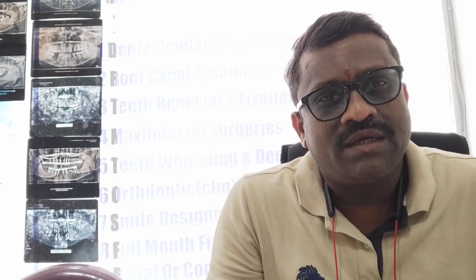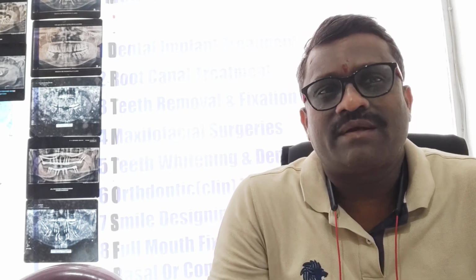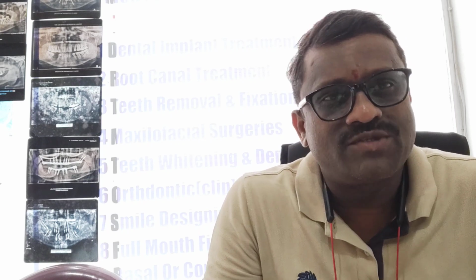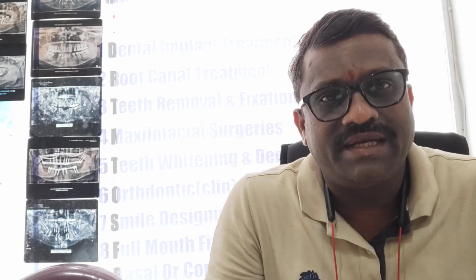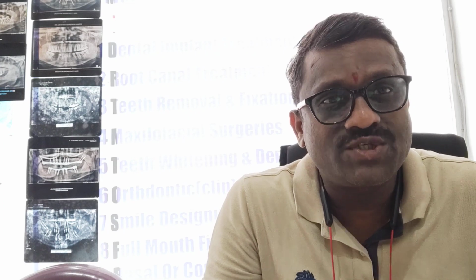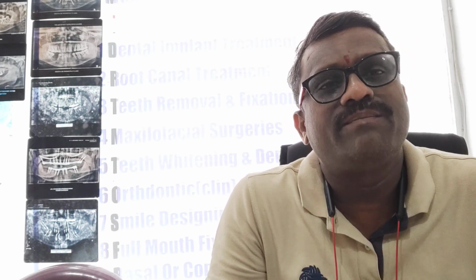If you want to remove the implant for any reason, in conventional implantology we use the low speed implant handpiece, whereas in basal implantology we use the driver to retrieve the implant if needed. Once the implant is placed in conventional implantology, we have to wait 3 to 4 months for osseointegration to happen. Only then do we go with the prosthetic part. Till then we can give a temporary crown.